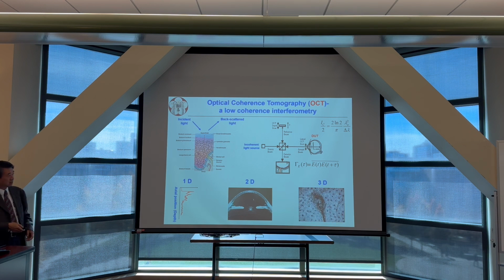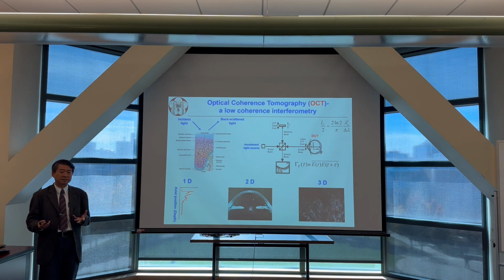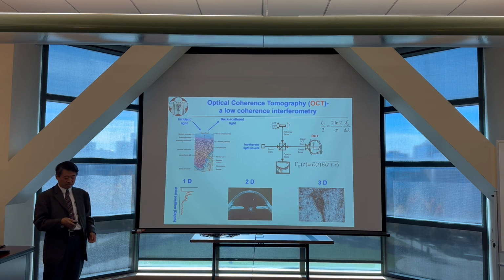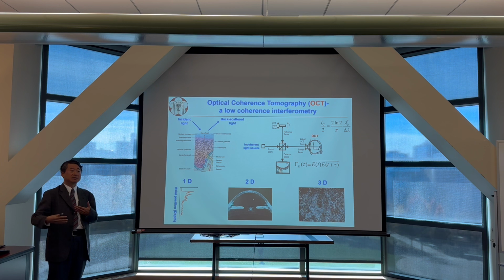So this one is a human histopathological. In the video, the time represents the depth of the histopathological. Because this OCT technology is very fast, on the one hand you can acquire this kind of 3D imaging, maybe in just 30 seconds you can have this 3D tomography. You can also use the temporal response to add color to your imaging.